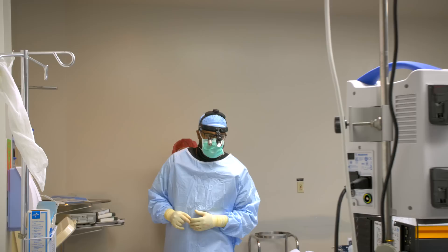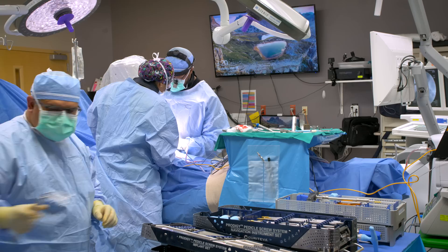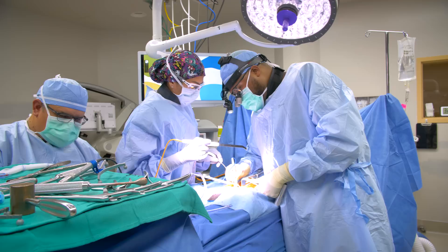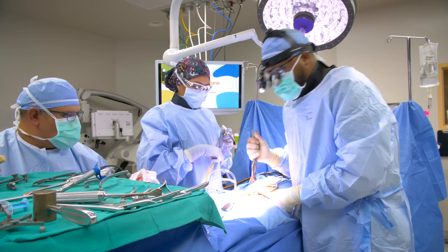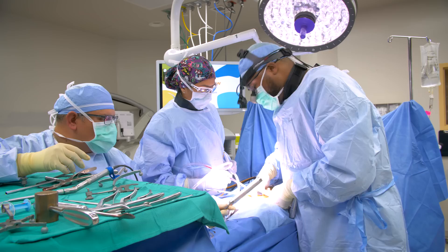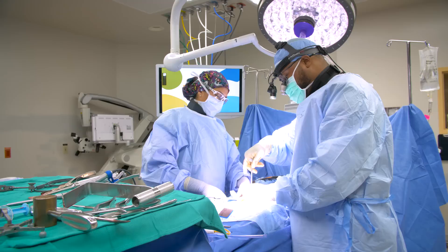We're going to cut to 45. I'm using these large Gelpi retractors and removing fat and soft tissue from the bone. Especially when we're trying to fuse the bone, we want all that soft tissue gone — otherwise the bone won't fuse. I'm stuffing Ray-Tec sponges into the wound to help with bleeding, providing a little pressure and hemostasis. I'm attaching a reference to the spinous process — this is how we'll acquire our images and connect the navigation after we get a CAT scan shortly. Just making sure that's really tight.